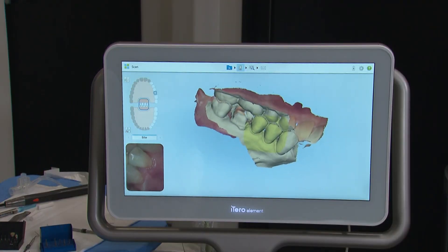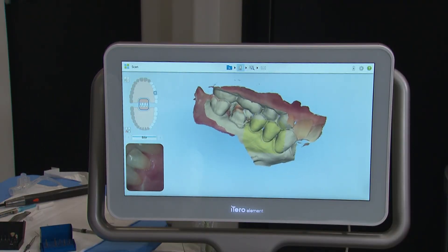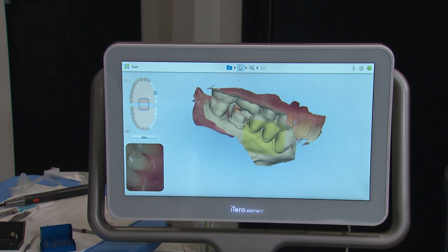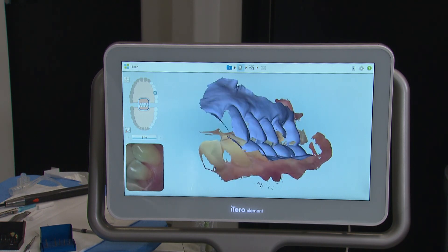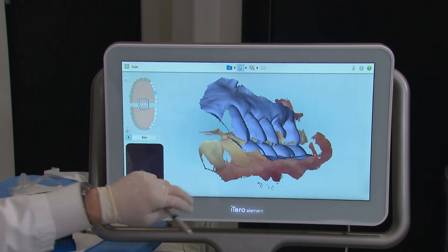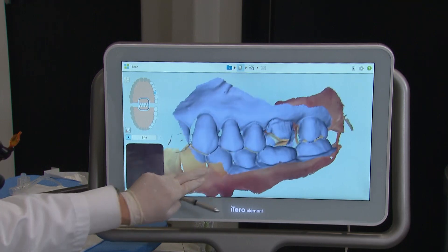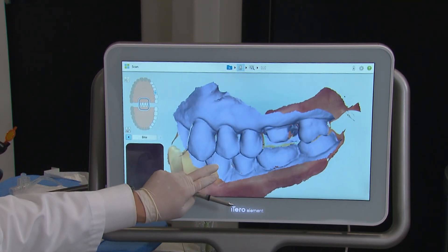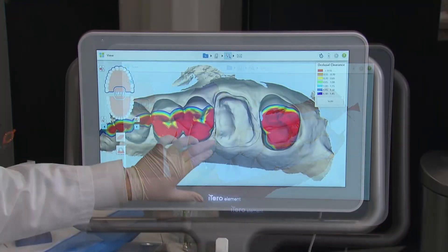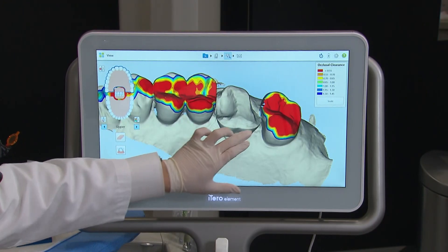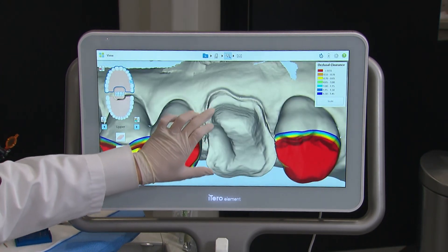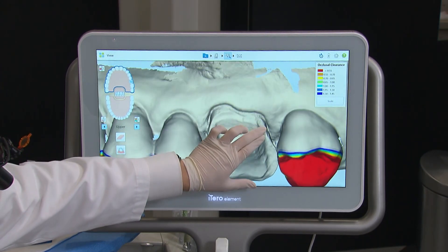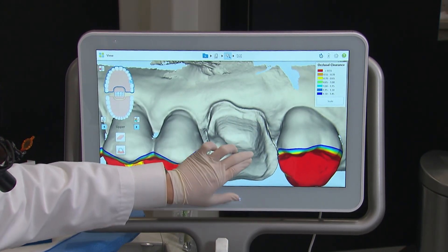Once the upper and lower digital models are created, the occlusion is established by scanning the buccal with the patient biting fully in centric. All of this digital information is relayed to the next stage of our crown fabrication process, the FAST Design software.